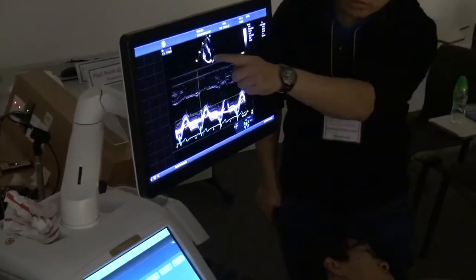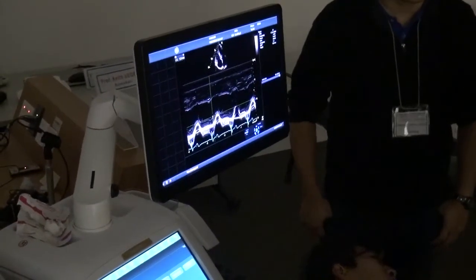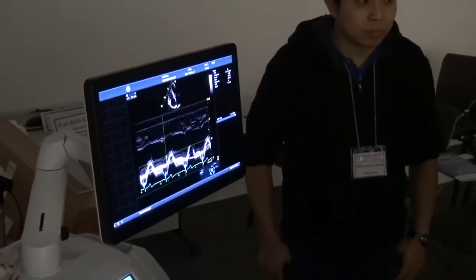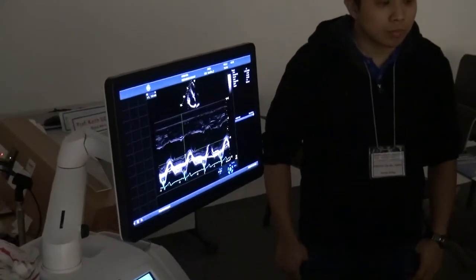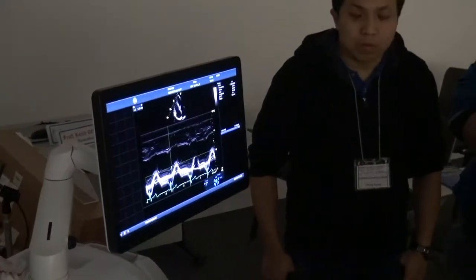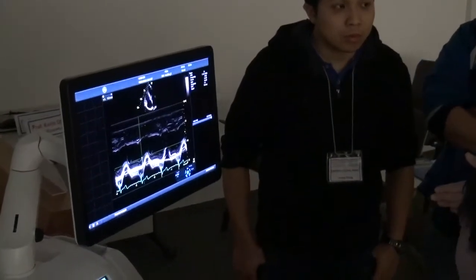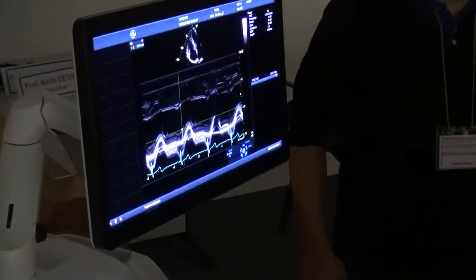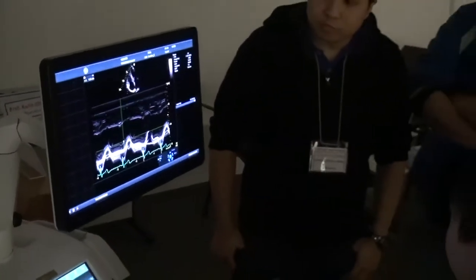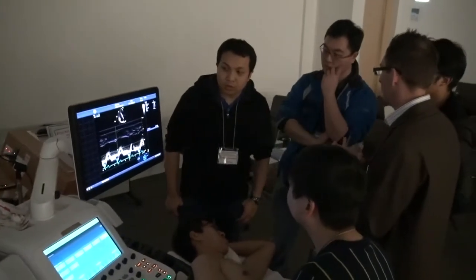Are we measuring the annulus? It's the annulus. So that's an important bit, that the right ventricle has this predominant longitudinal function. So in pathology it changes a little bit, but in healthy people, that movement from the base to the apex is a predominant drive of ejection. And therefore, if you put the line through the annulus of the right ventricle, that movement correlates very well with its overall output. I will say that when you see certain diseases, it changes. It's not sensitive in things like that.